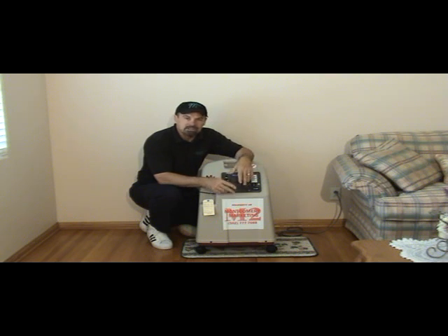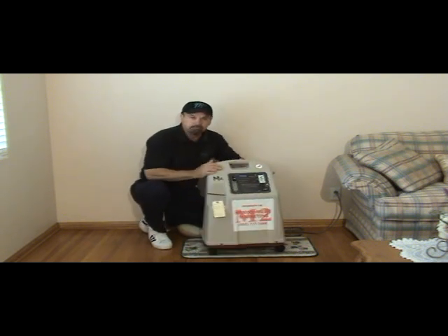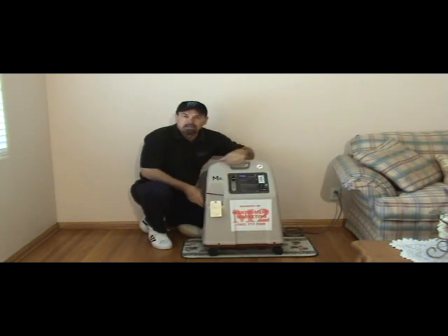Remember that a concentrator is the safest way to provide it because it is drawing air from the room and is not saturating the room in oxygen. However, you should keep it away from external heat sources. About once a week, there are two filters on the sides. You can see them here and here. These should be checked. They will collect lint over time.